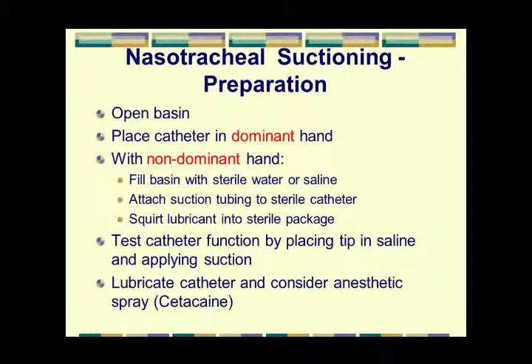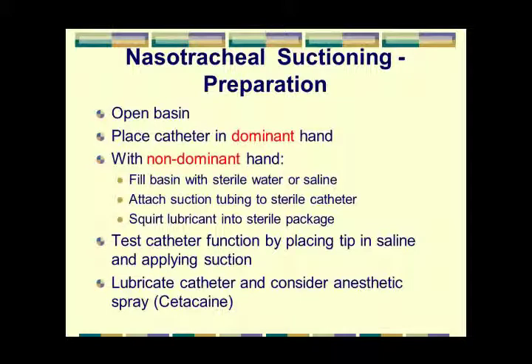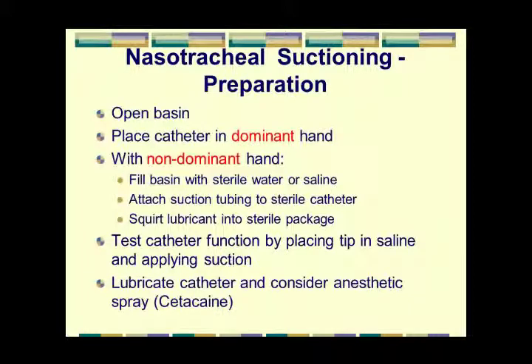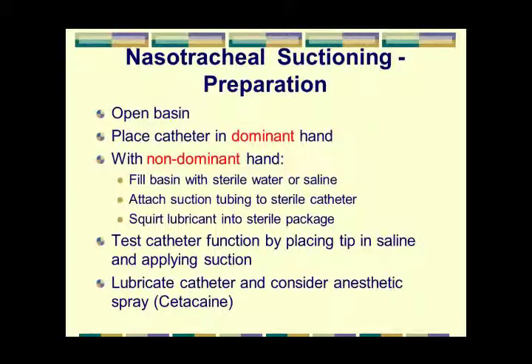Other hand now becomes non-sterile. I grab the water bottle, I pour water in a sterile fashion into my little basin there. I grab the suction tubing and attach it to my suction catheter. I can now open it up, holding on to the very tip. I can verify suction function by taking the tip into the sterile basin in a sterile fashion and applying vacuum.